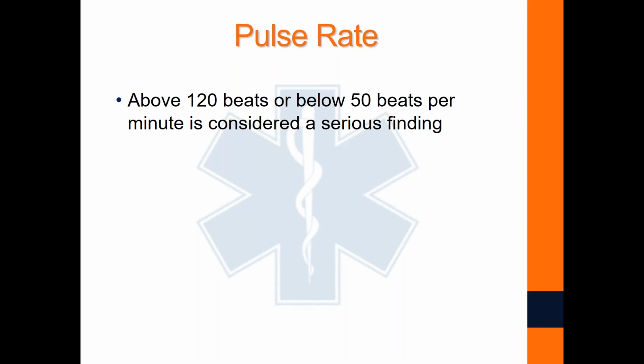Just make sure you're measuring everything together, because let's say you're providing standby for a sporting event, and somebody comes running off the field and your initial pulse rate is 122, because you're checking them out for some sort of injury, anything really. Well, they just ran from one side of a football field to the other to come over to me. So wait a minute before we sound the alarm. Use just a modicum of logic, right?